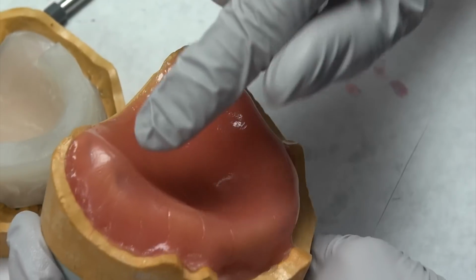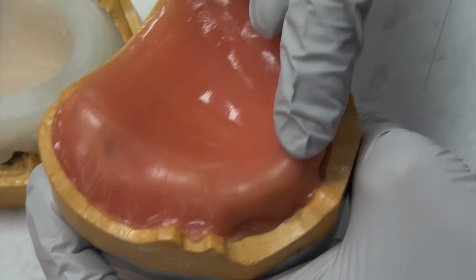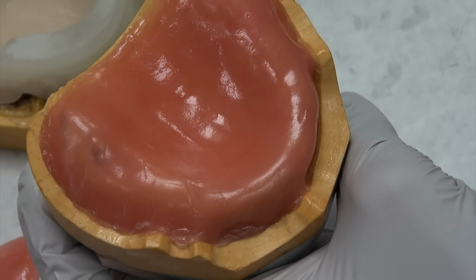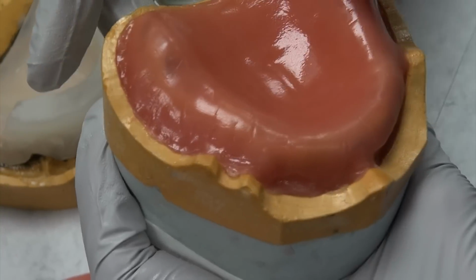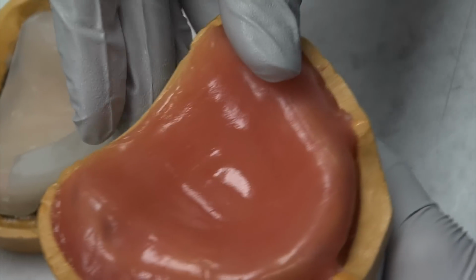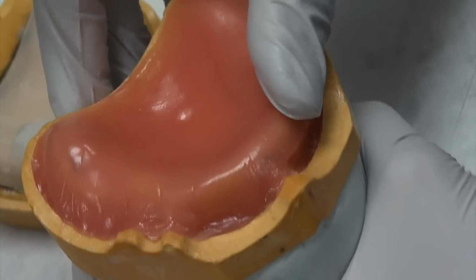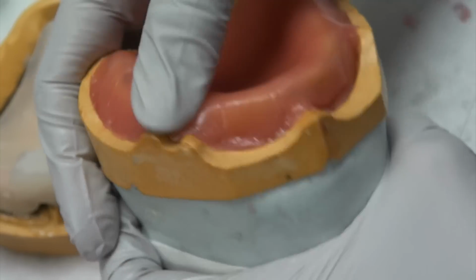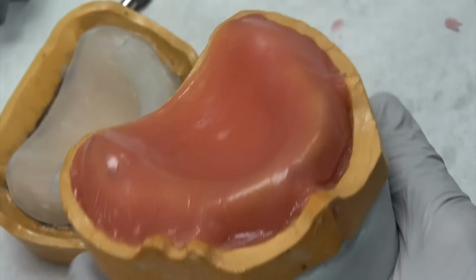Okay, so see how the color is starting to change to a translucent color here versus the dark pink that you see. Okay, so that's what you're shooting for. Once you see that translucent yellowy orange color, you know you're getting to the right thickness. So the crest to the labial surface.